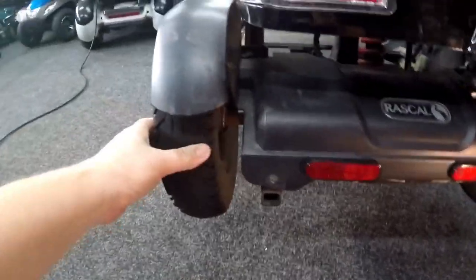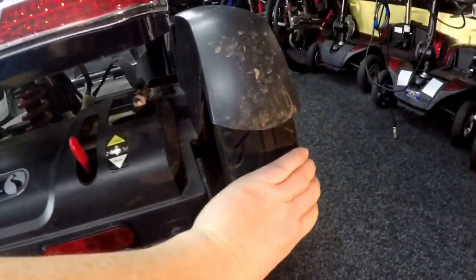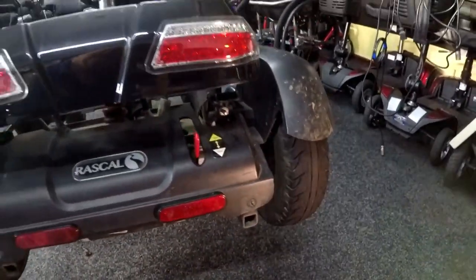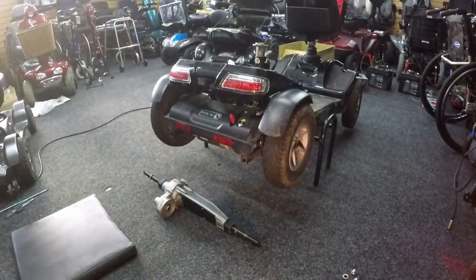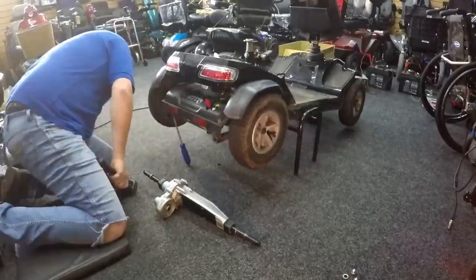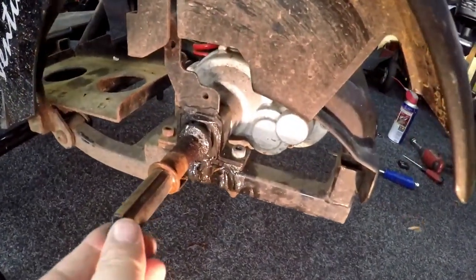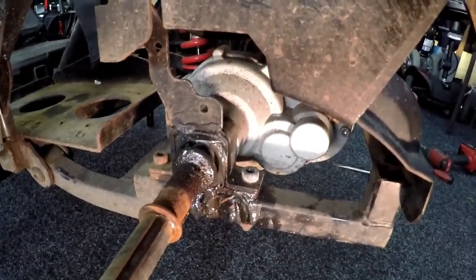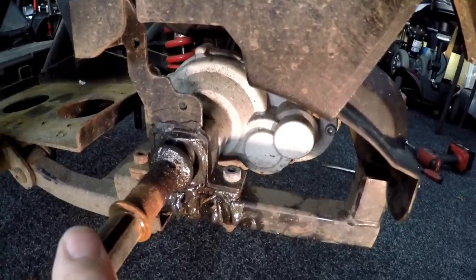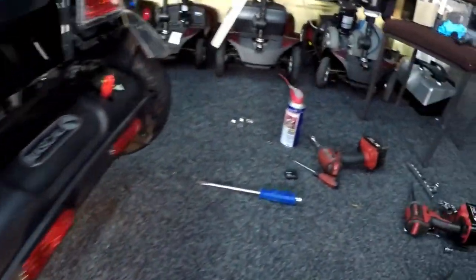Taking the wheels off. As you can see, it's had it. This one's okay, but hey ho, kind of on one wheel. So we'll just do that right now. And there you can see, after removing the wheel, how bad the transaxle is. A bit of a pain that the customer was told the scooter's 2 years old when it's actually 4 years old. But here goes.